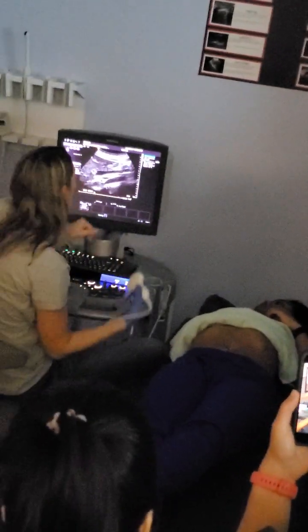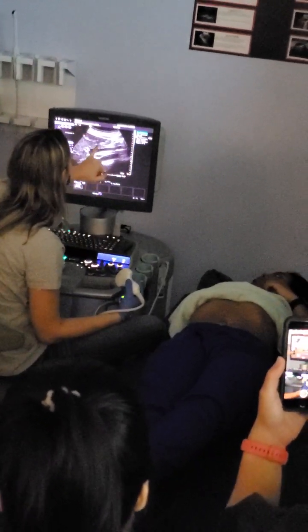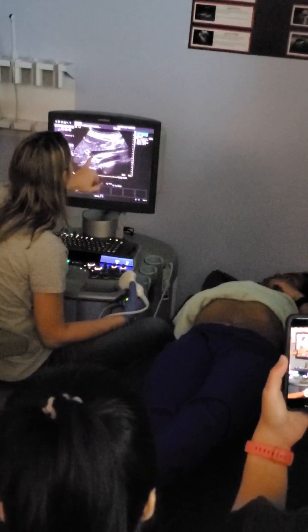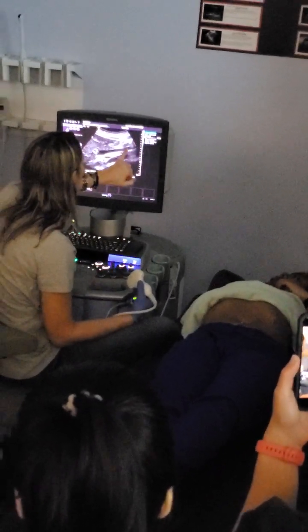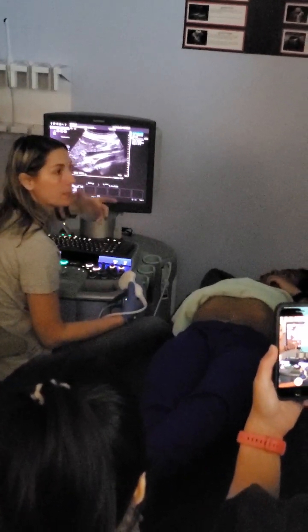Does that make sense? She doesn't have a lot of uncinate. Some patients will have a little bit more uncinate right in here. But here's the head. The top bun is going to be the head. The burger is going to be the portal splenic confluence, SMV, IMV coming in. And then, not a lot of uncinate, but our bottom bun would be the uncinate. So the Pank hamburger.